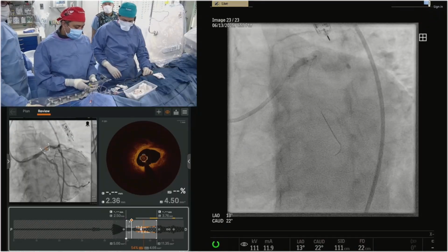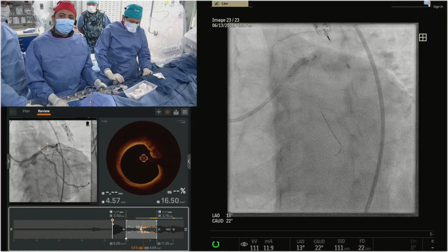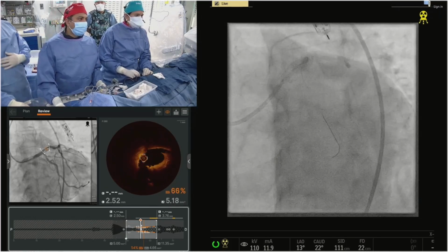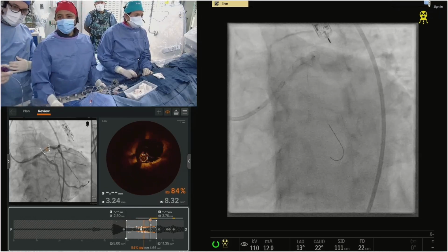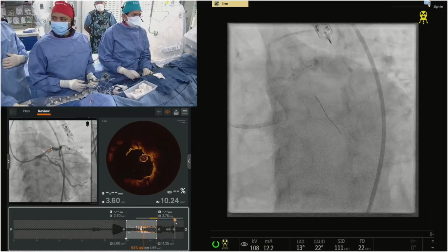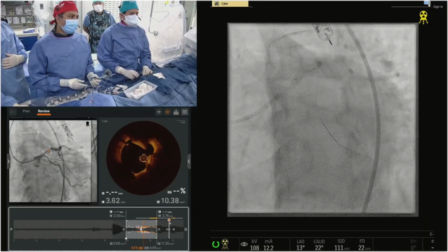I think it's just a deep intimal tear. I do think we will see after we stabilize it with the stent. We can't be sure until then. It's just a bleed. We knew it was a deep intimal tear. I think it'll look better after this. Okay, go down a little bit. That's basically a perforation inside there, right?